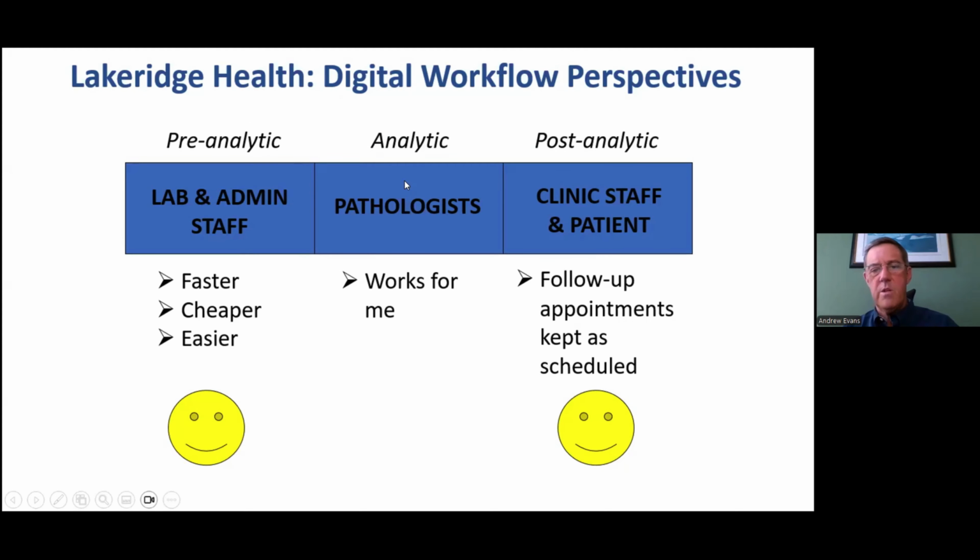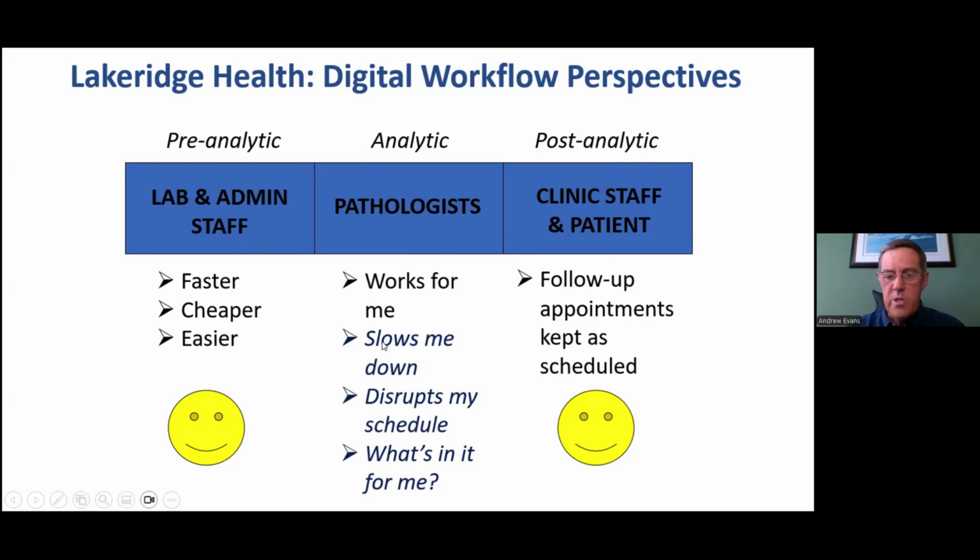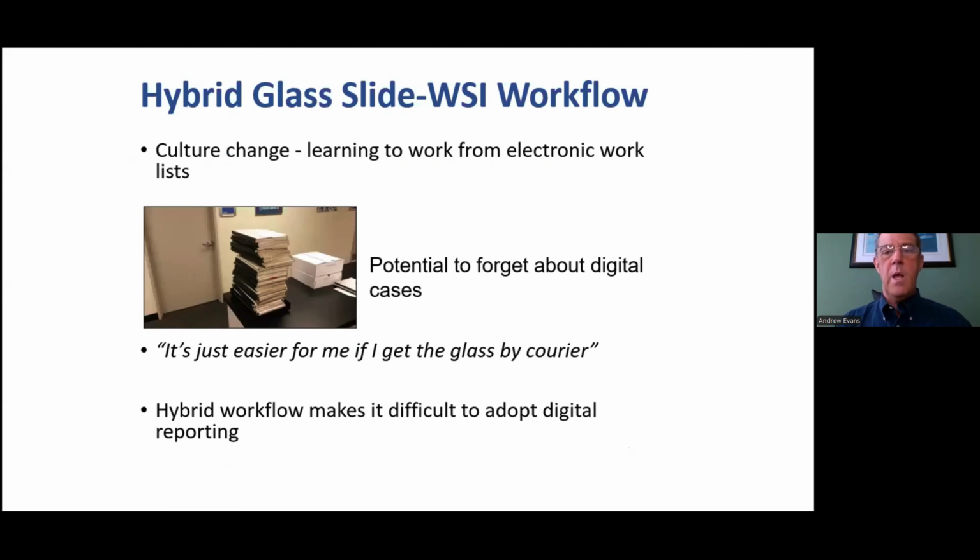If we looked at the pathologists that were involved, it was a mixed bag of opinions. Some said it worked for me, recognizing also, to be fair, that the technology was new at the time. Others said it slows me down, it disrupts my schedule. What's in it for me? So these are some of the things that you need to expect when you introduce digital into your diagnostic environment. And it also highlights the issue of a hybrid glass slide, digital slide workflow.